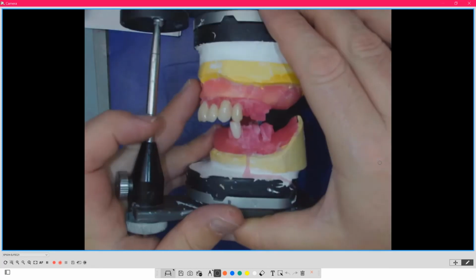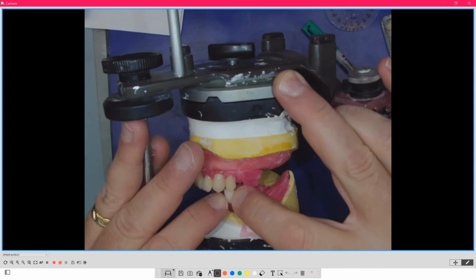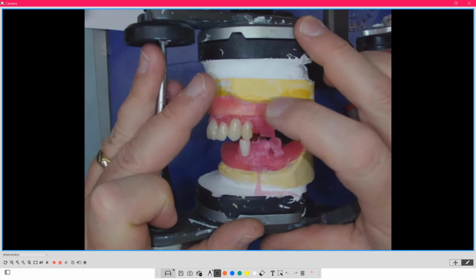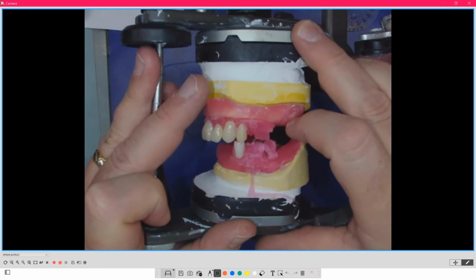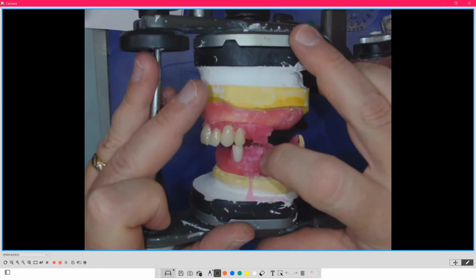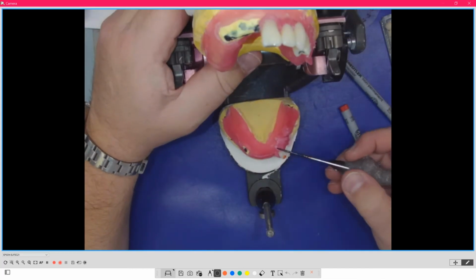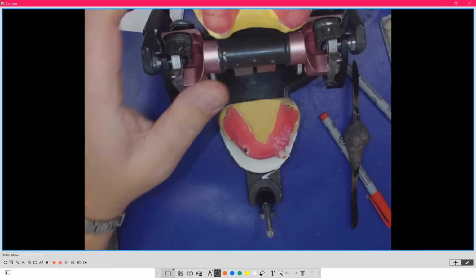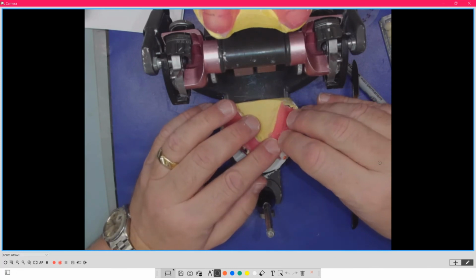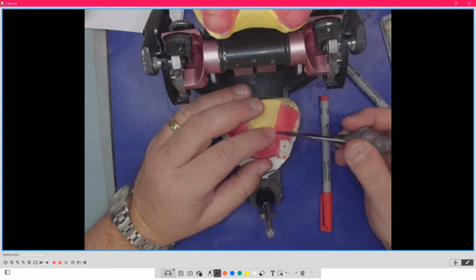The other thing that we typically see with a class 2 case is we don't have a lot of space. So what that means is we typically are having to drop some sort of a tooth on the bottom, yet we can have the full complement of teeth on the top. And so sometimes we run into problems because it's hard to line things up appropriately so that the right tooth is over its proper antagonist. And that's where, again, freedom teeth allow for that flexibility, that we have way more flexibility that if we can't make it work, it's still going to work. So let me explain what that means as I quickly set some teeth to show what the example is.